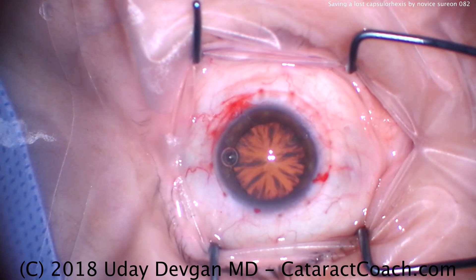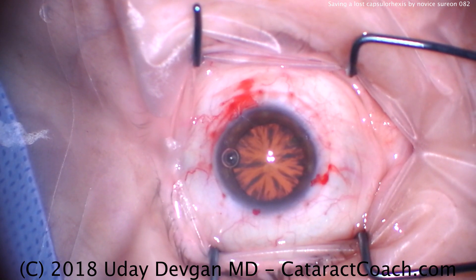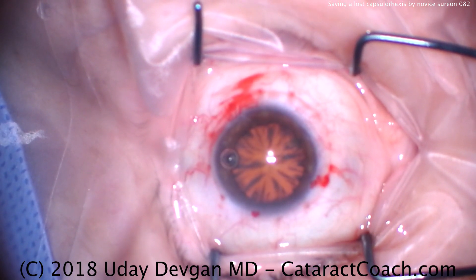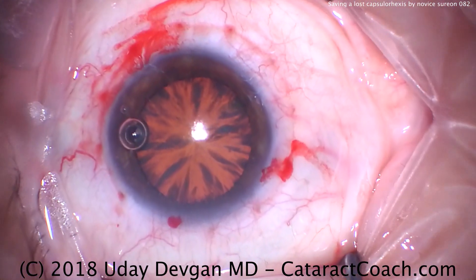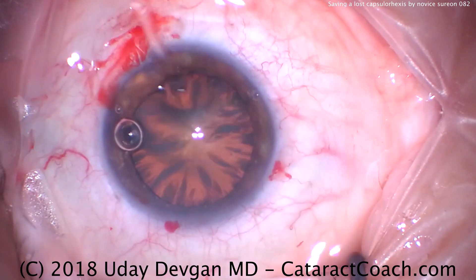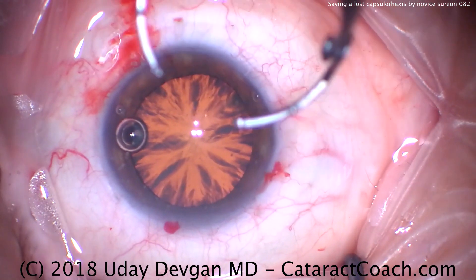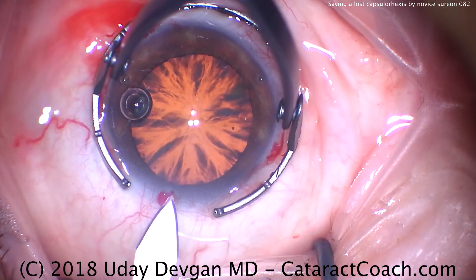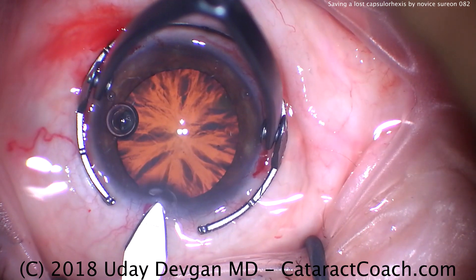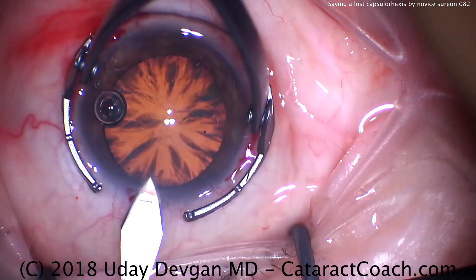With a resident case, you've got to be very patient — things take a lot of time. The fixation ring is placed down. The light went off for a moment while figuring out what the pedals do to control the view, focus, or zoom. Getting a more appropriate level of zoom, a little BSS on the cornea to keep the eye hydrated. Fixation ring down, and now the main incision is done with the keratome — a single plane incision that looks pretty darn good.